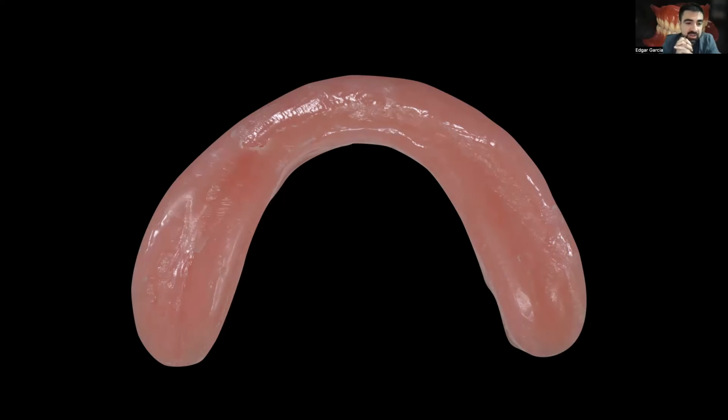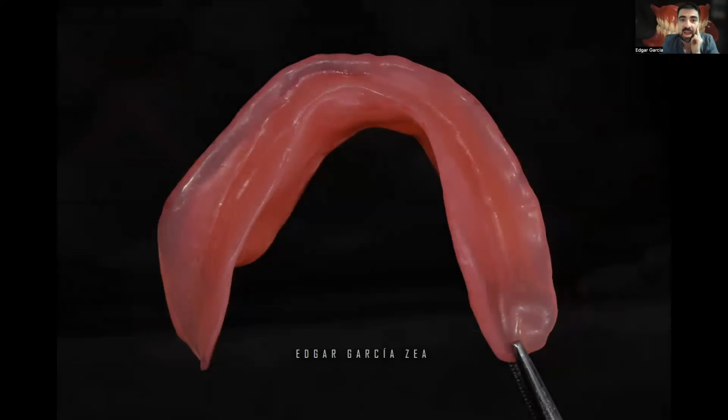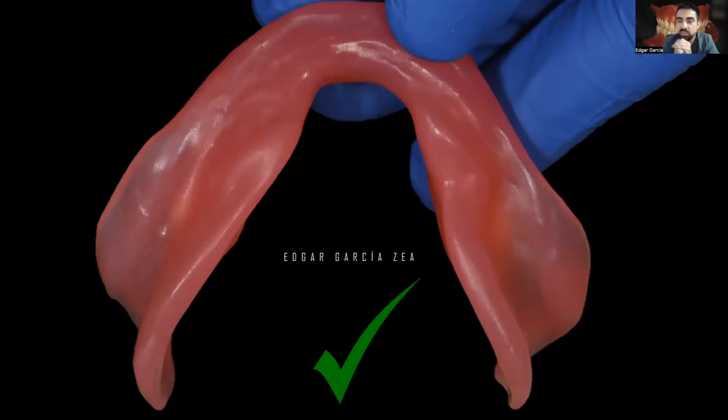Because every day I receive patients with complete lower dentures that dance. They have no retention. You look at them and they dance. They have zero retention. And you can see that there's a lack of knowledge, because this is not what a lower denture is supposed to look like. Unlike what we were taught in dental school, the form of the lower dentures that we are making today is a lot bigger than the ones we were taught at dental school, okay? This is our goal.